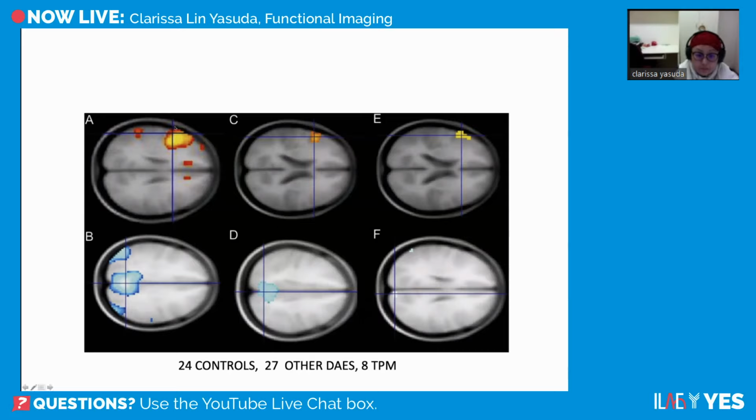So here we have the normal subjects. You have normal language activation. We have patients taking other drugs with a smaller activation, and patients taking topiramate, with a very small activation. But the interesting part is that in the normal controls, when you activate an area of language, you have to deactivate this blue area here.